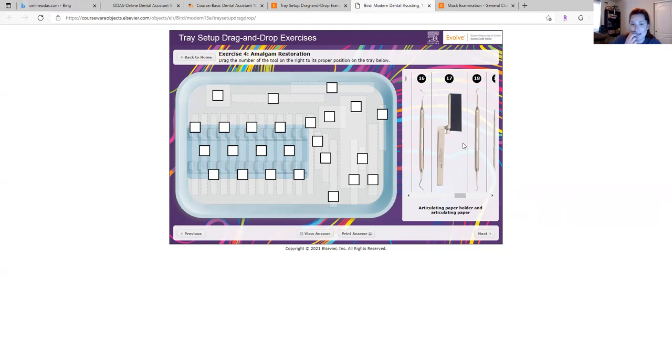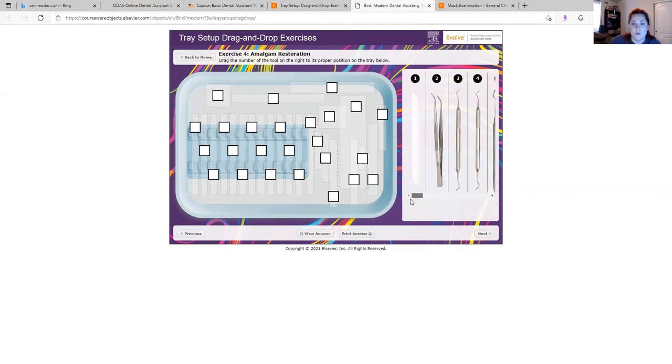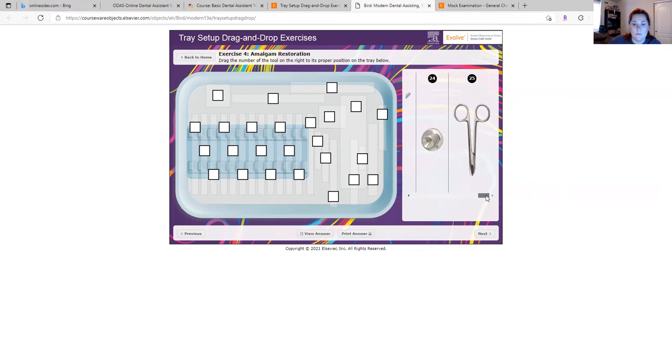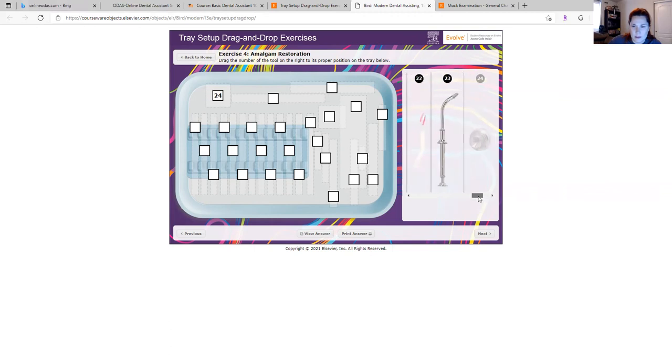And basically you just go through here and you drop where things go. Your amalgam well would go here. And let's see.